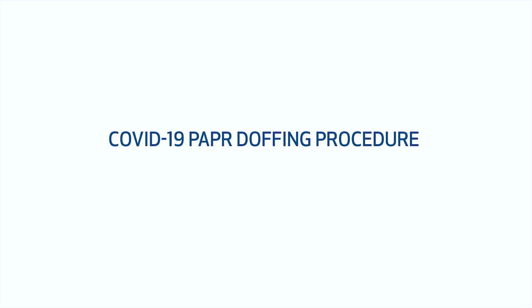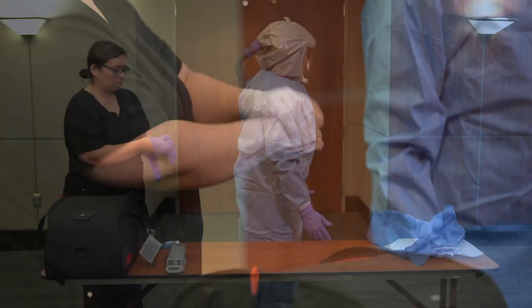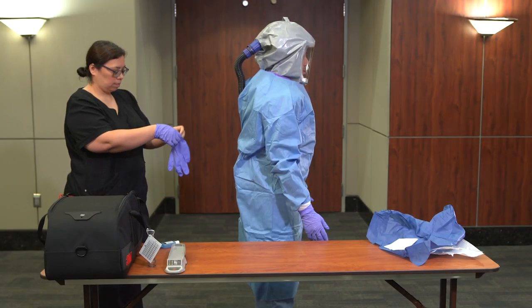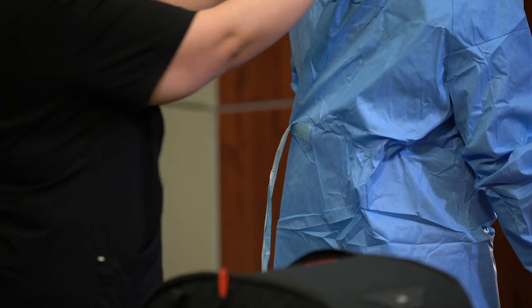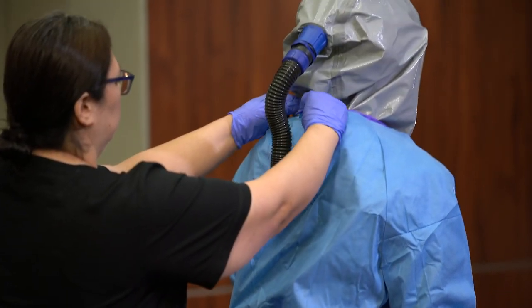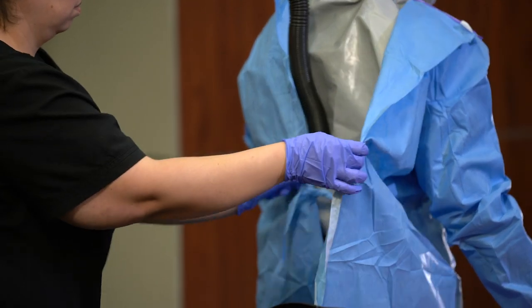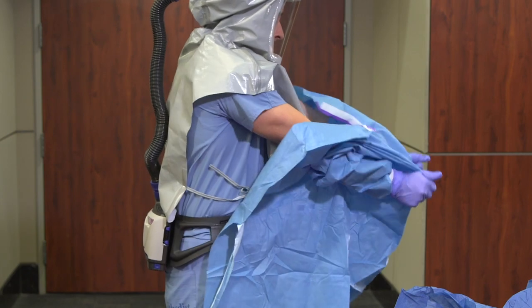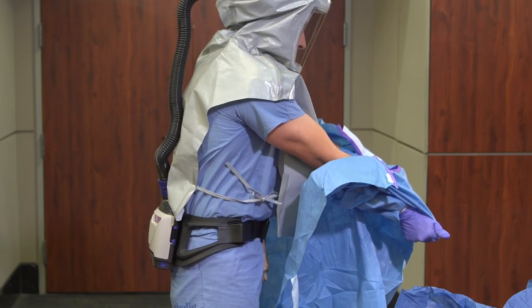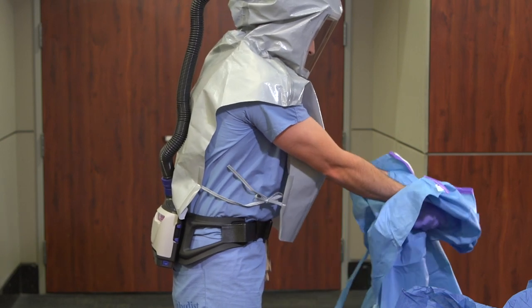Doffing procedure. Doff the gown. The buddy should perform hand hygiene and don gloves. Turn your back to the buddy and ask him or her to unfasten the gown. The buddy should only touch the outside of the gown during assistance with doffing. Grab the gown at the chest and pull forward. Do not bunch or bundle the gown during doffing. Place the gown into a waste container.